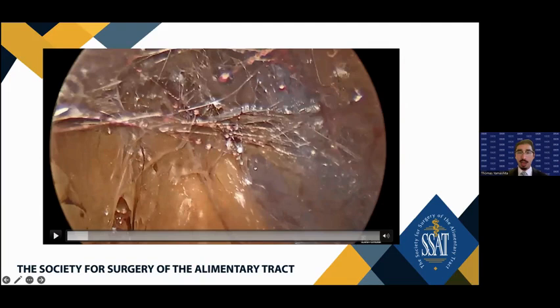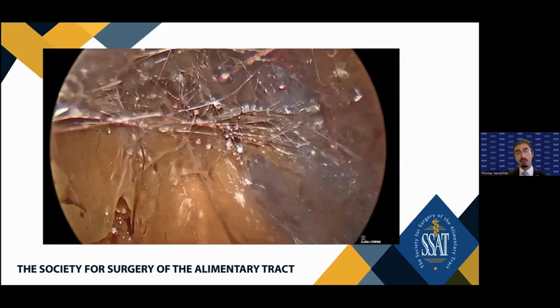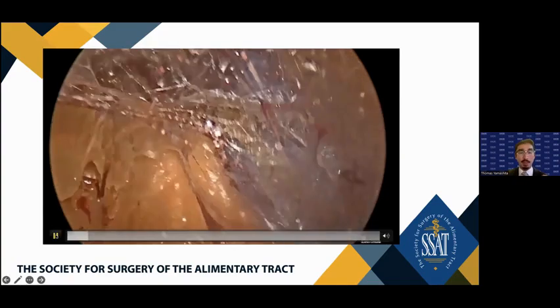Now, I pause here again because this is the peritoneal reflection. This is the lateral. I like to think of this as a pyramid, which on the medial side, you have the paraspinals. On the lateral side, you're going to see the peritoneal reflection. The base of it is going to be the kidney. And the tip is what you don't want to take, because that's the fat that is keeping the adrenal up; otherwise it'll be flopping around you.